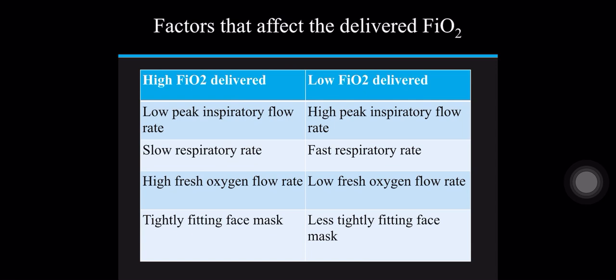In the same way, respiratory rate relates inversely to the FiO2 delivered. This means that with a fast respiratory rate, there is less expiratory pause, and the patient will rebreathe their expired alveolar gases. So the FiO2 will be low. Next, I will explain it with a figure.